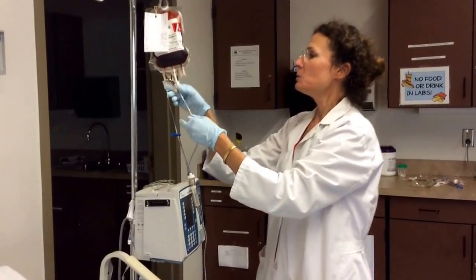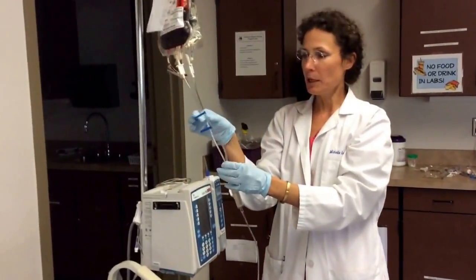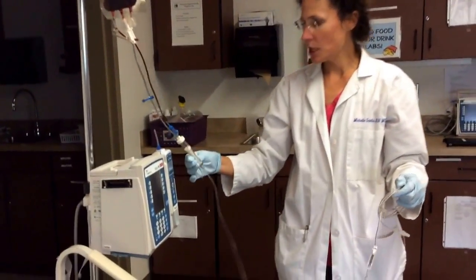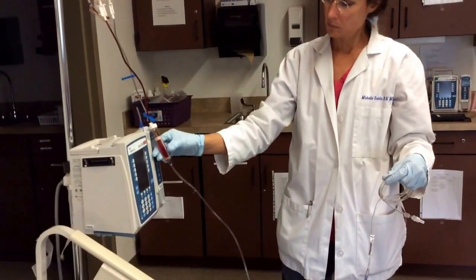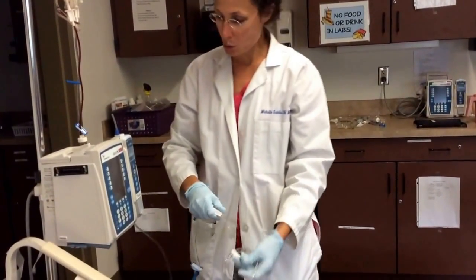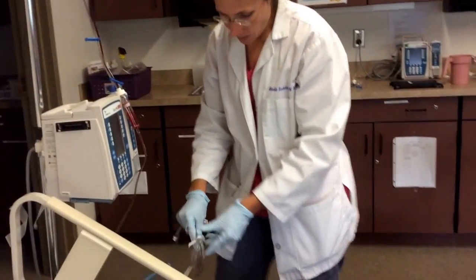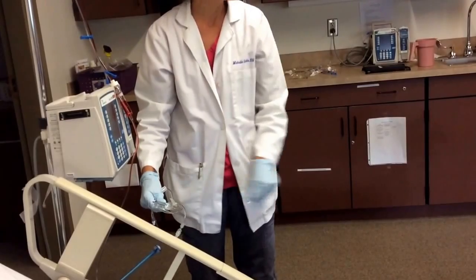Okay, at this point, I'm going to open the clamp on the blood. The saline remains closed. I'm opening the clamp on the blood. I'll squeeze the chamber. And now I'm going to open the tubing and allow this blood to flow until I have some pink start to show at the hub.